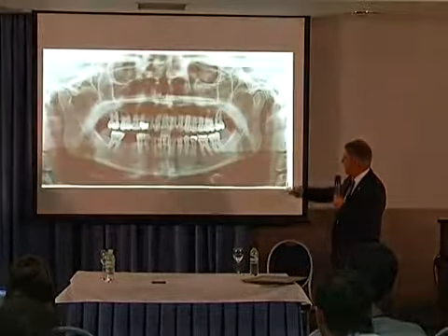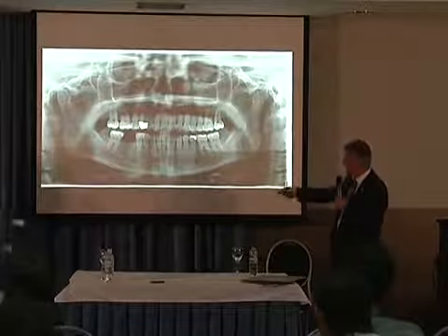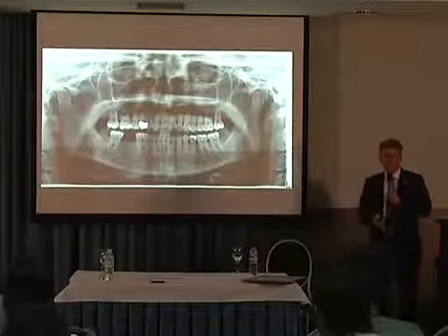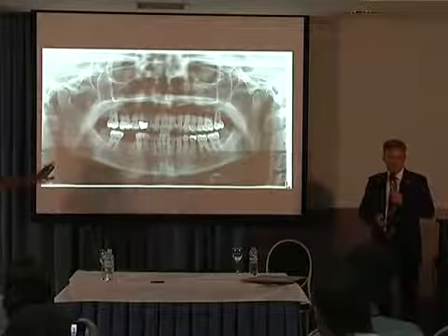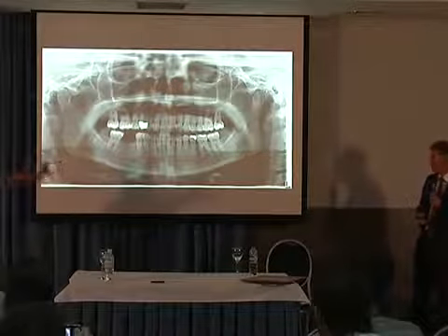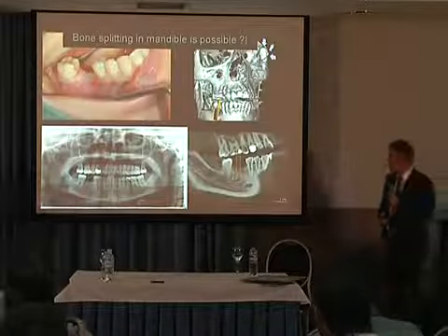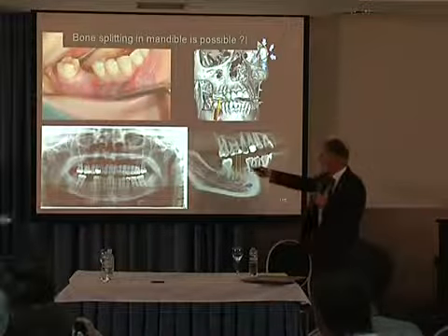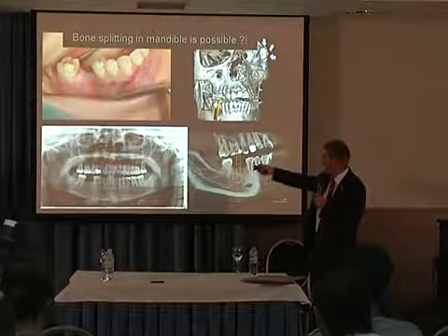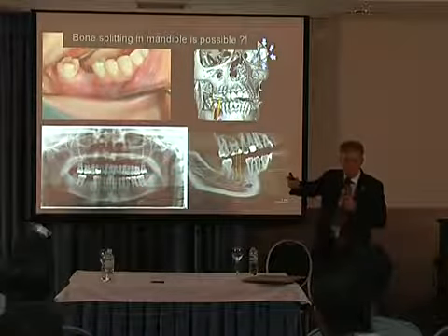Two-dimensional panoramic gives us a vertical bone excellent. Панорамная рентгенография нам дает очень четкое представление, что мы имеем достаточно по высоте костной ткани для того, чтобы поставить имплантат серьезной длины. The problem when we check it clinically, we miss keratinized attached mucosa and we have a severe undercut. Our horizontal bone amount is limited.